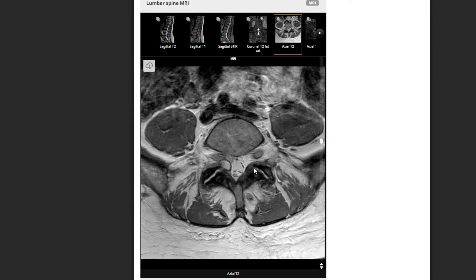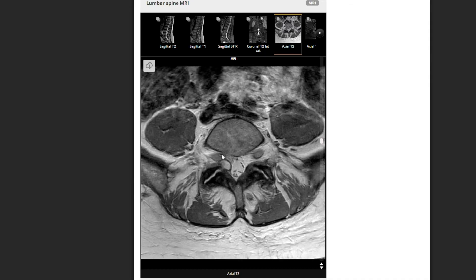The inner edge of this facet joint is a little more arthritic, but here on this facet joint we have something extra: a facet joint synovial cyst, which is an outpouching of the joint fluid. That can be a sign of degenerative facet disease, and it's something that can pinch on the neighboring nerve, as it's doing in this picture.